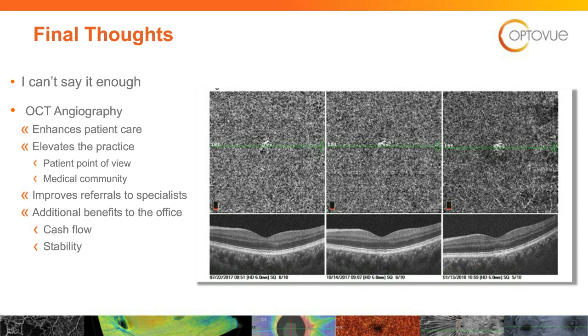I'm not sure if I can click back and find exactly where I want to be in one of these slides. But that's, I guess, 201 and 301 interpretation of these images. That's where the blood flow measurement comes into play. That's where AngioAnalytics becomes so important. And when there's no flow in those drusenoid type of patients, and when there's activity, that's where you'd want to focus.